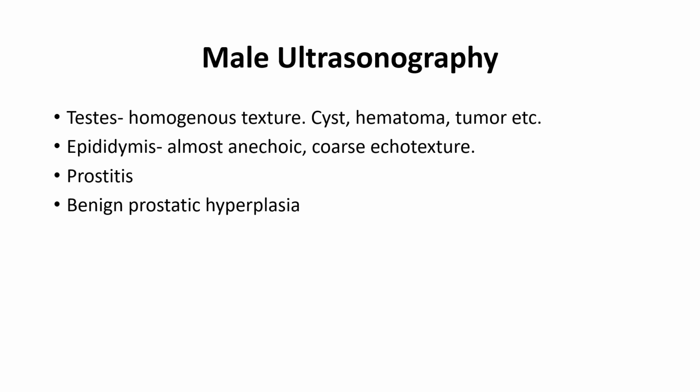In male ultrasonography you can detect prostatitis, or you can observe the inflammation of the prostate gland, and you can also observe the tumors of the prostate gland.